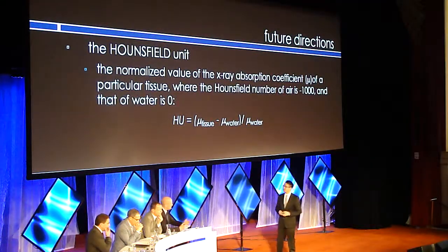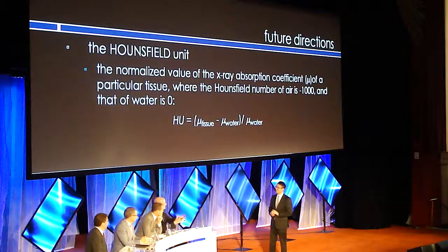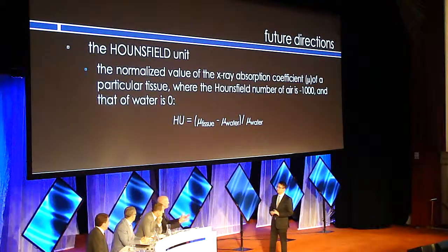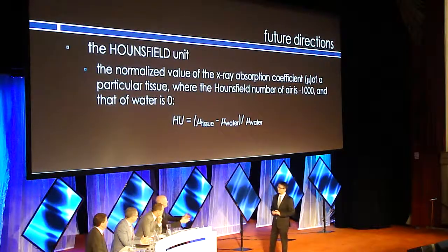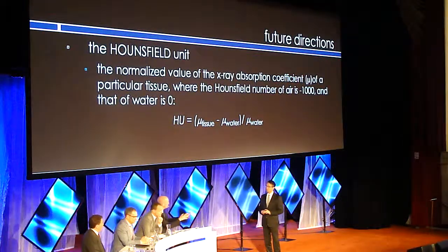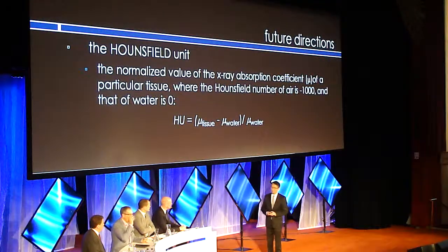Very good, but as you said, we have so many parameters now that we can change, the field of view, and obviously the radiation dose that we expose the patients to. What's the room for improvement? How do we continue with this? Will this be complicated? Do we need to decide for each and every patient what the field of view is, and what radiation is ideal for a certain treatment, or will the software or the systems help us in the future? Sure.